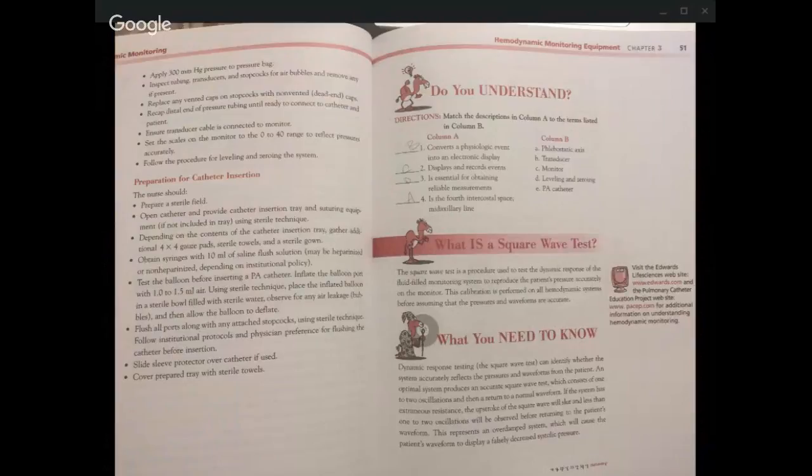If the system has extraneous resistance, the upstroke of the square wave will slur and less than 1 to 2 oscillations will be observed before returning to the patient's waveform. This represents an overdamped system, which will cause the patient's waveform to display a falsely decreased systolic pressure.